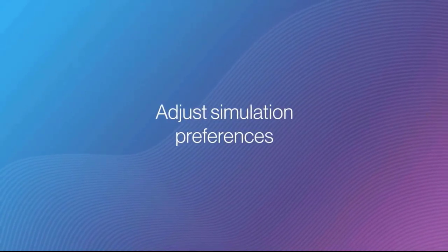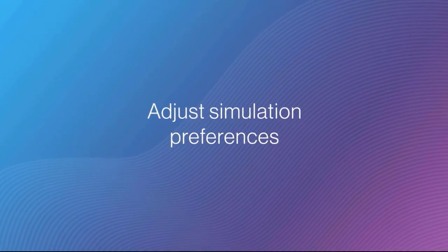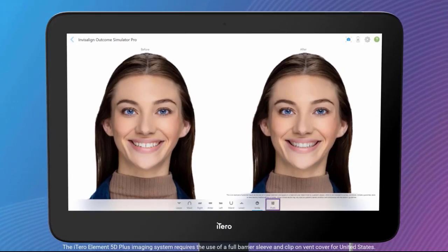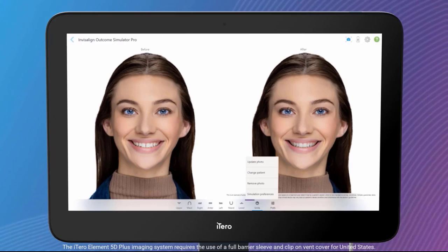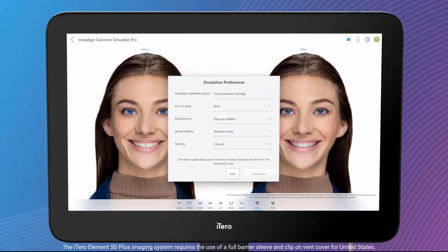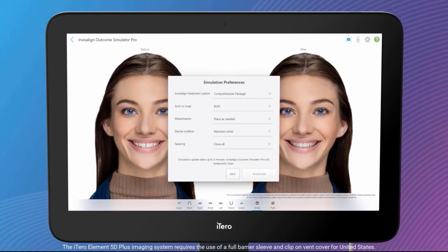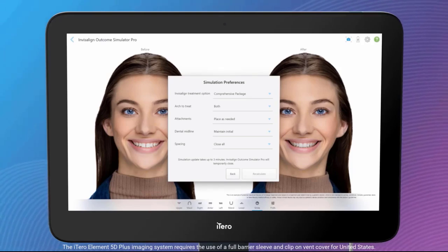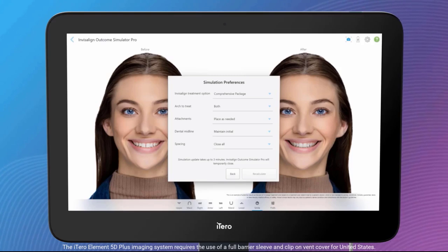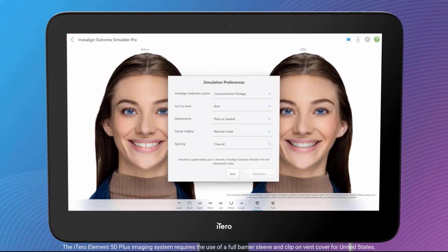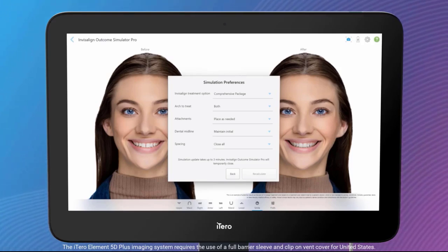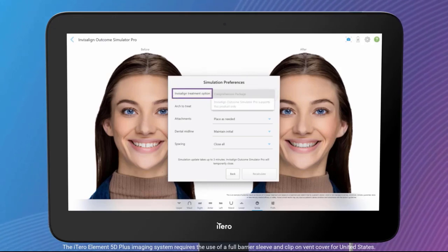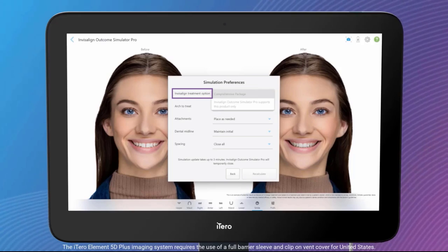Now, adjust simulation preferences. Simulation preferences allow you to modify the simulation according to clinical preferences. Choose simulation preferences from the drop-down list after tapping on the Preferences button. You are presented with the default simulation preferences. The Invisalign Treatment Option allows you to choose the treatment option to see what the simulation would look like leveraging a different Invisalign product.